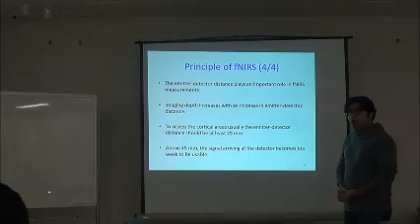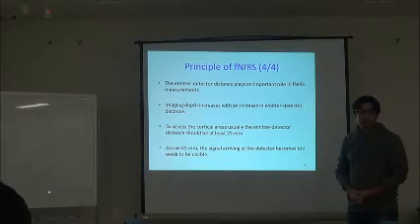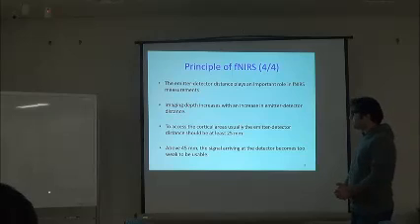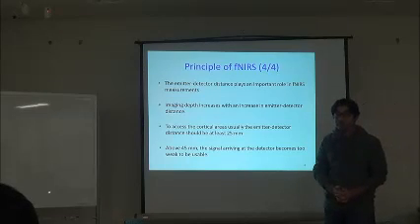Well, that's one really important thing that I have touched on a little previously. The emitter to detector distance is very important in fNIRS measurement. Imaging depth usually increases with the increase in the emitter to detector distance. And to access the cortical areas, usually the emitter detector distance should be at least 25 millimeters or 2.5 centimeters.